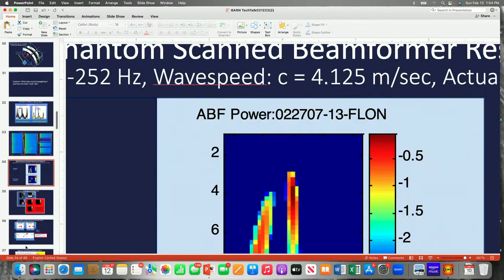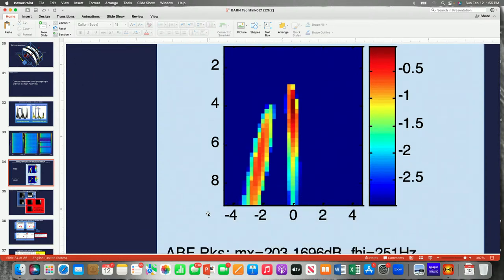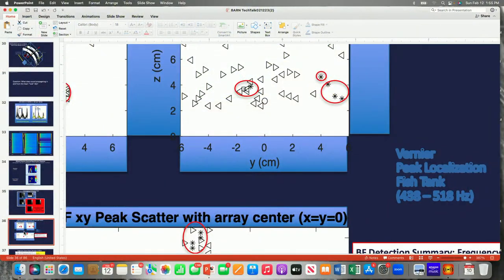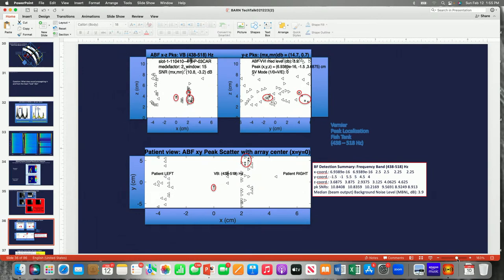Okay, we focus beamform, we focus the image, and we get stuff that looks like this. Again, this image is distorted. But we get 40 of these images, one at each depth slice. And no cardiologist is going to take the time to page through all of these slices at different depths, believe me. They want a number, or they want an image that's concentrated. So we present first what we call the fishbowl display. This is a display of the peak values in that noise measurement.